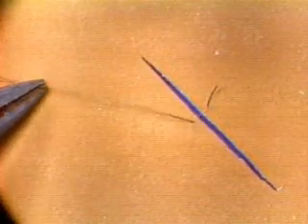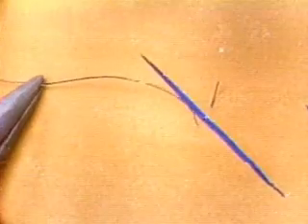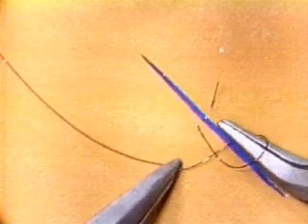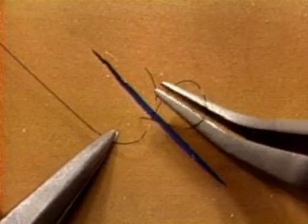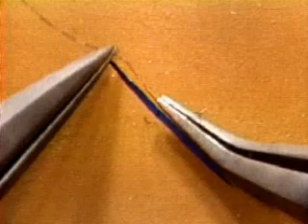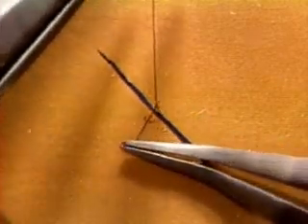It's useful to consider each of these separately. Here they are. First, you pick up the thread with your left hand forceps. Second, you make a loop of thread on the tip of the right hand forceps. Third, you pick up the end of the thread with the right hand forceps. And fourth, you pull the end of the thread through the loop.